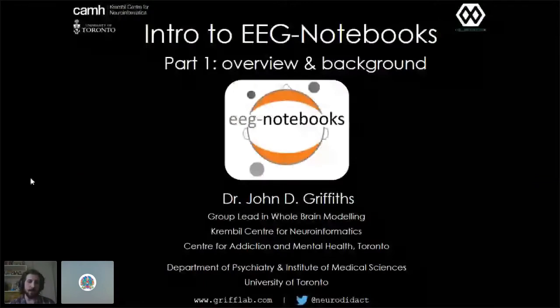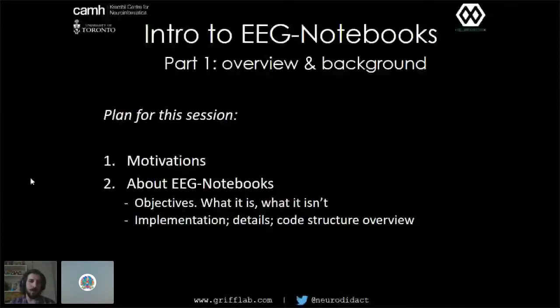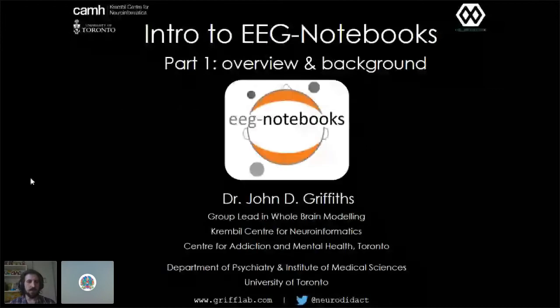This is going to be a 2-part session. The first part is going to be a slide-based lecture overview and background, me and some slides, and you guys watching on the Crowdcast. The second part is going to be a live demo tutorial where I'm going to give some examples and go through some of the tutorials that we have for the tool, and expand on the notes and comments that are in the documentation already.